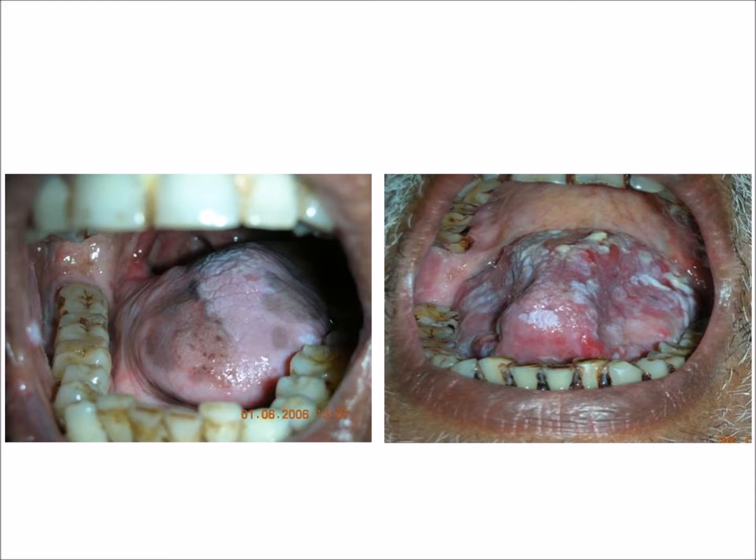Now, the first picture that we are seeing here is an ulcerated lesion, typically what is called in the textbook a cauliflower-like lesion. This is a typical lesion of tongue which can't be anything else than oral cancer.